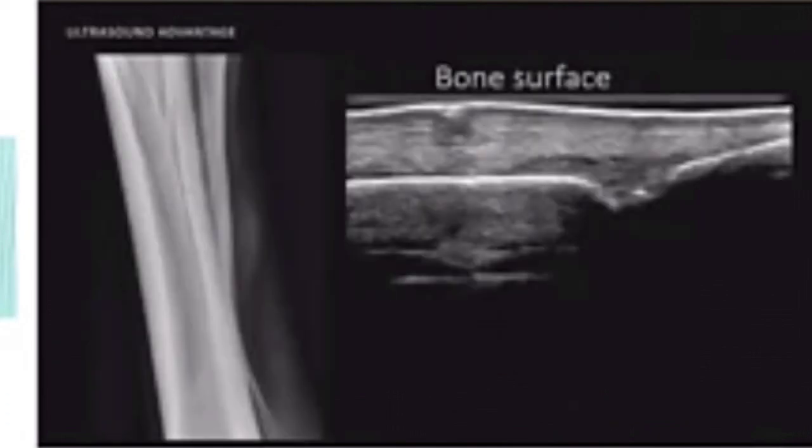The other thing where ultrasound is really helpful, as related to MRI, but it's just a little practice tip. If you're looking for fractures within the splint bone or any other surface fractures, or if it's in a more proximal area that became challenging to radiograph, ultrasound is a lovely diagnostic tool for that. You just follow down the bone. It's much easier to see bone defects at the surface with ultrasound than it is with radiographs, and sometimes than it is with MRI. And so here is an example of a splint bone fracture that we can see much better with ultrasound than we see with the radiographs.